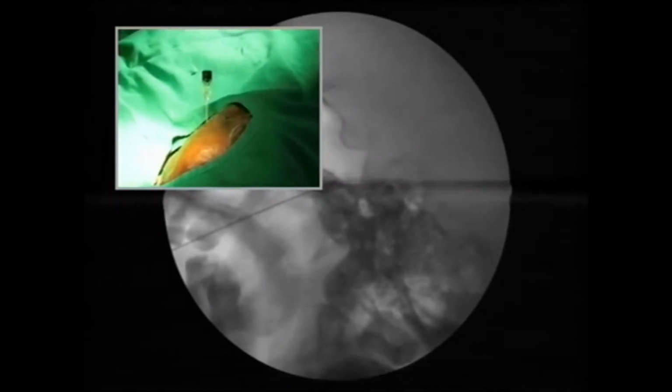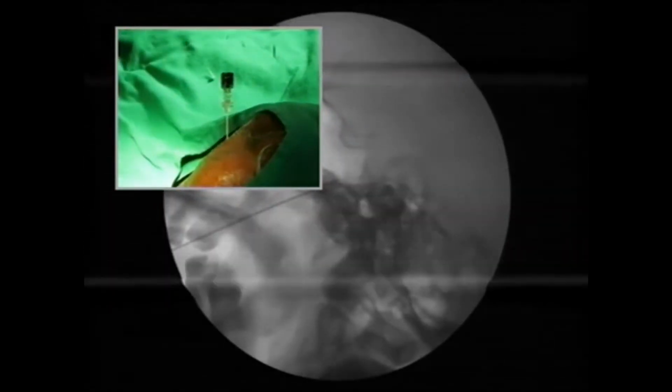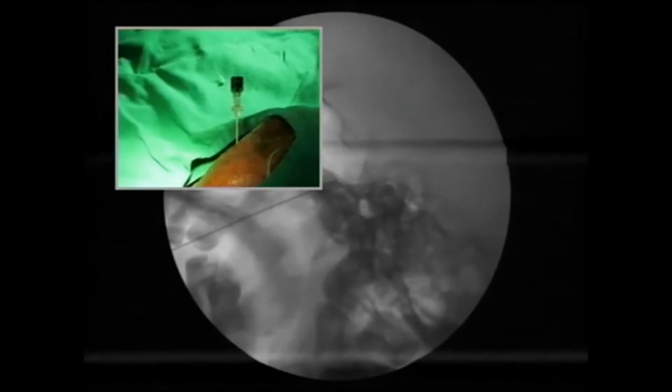Okay, Karthik. Shoot again. Just show us on the screen, on the lateral image, the V1, V2, and V3 distribution. Where should we place the tip of the needle for V1, for V2, and for V3? Okay, get back to that.